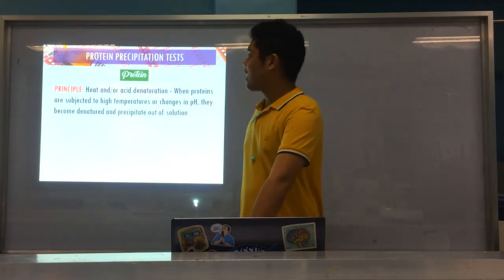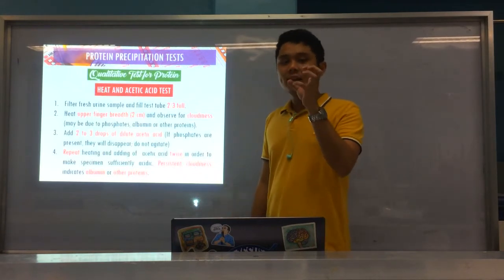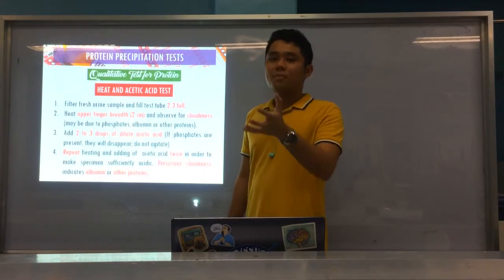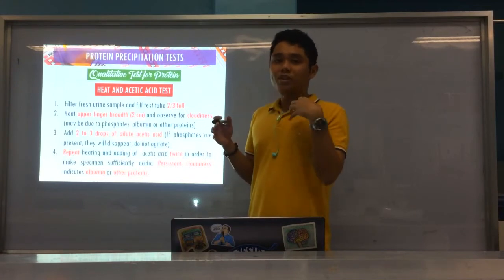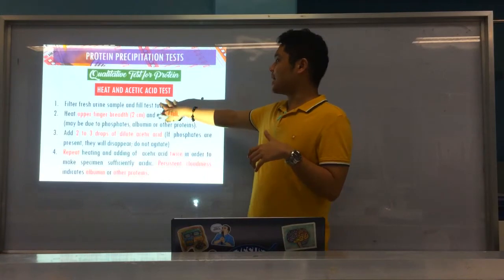Alright? Okay. So, we'll start first with the qualitative. When you say qualitative, it doesn't have a numerical counterpart. It's just subjective. We just grade, like plus, okay? So first is heat and acetic acid.